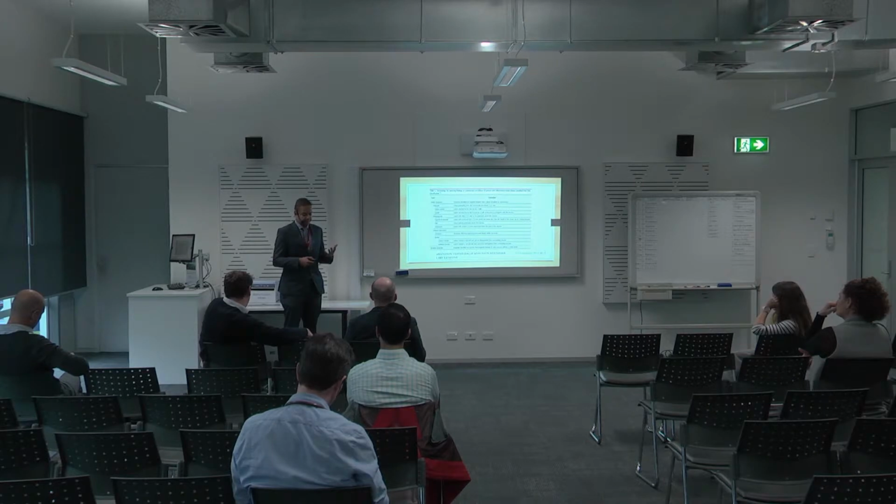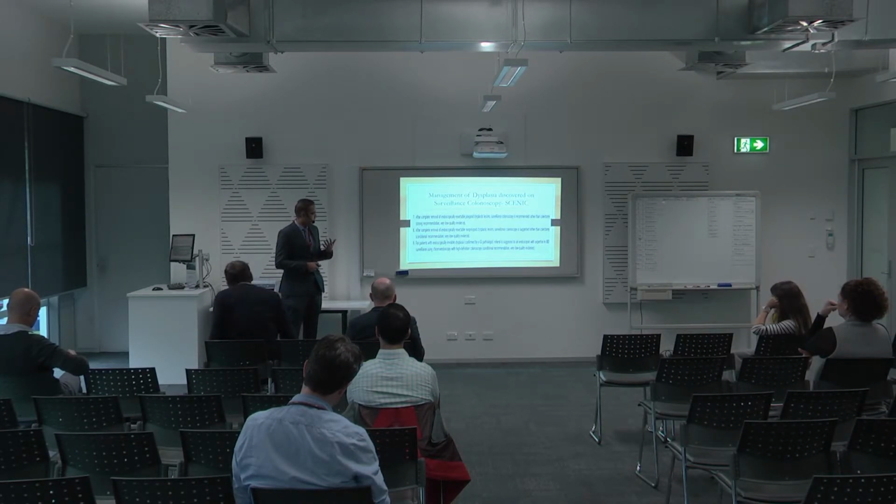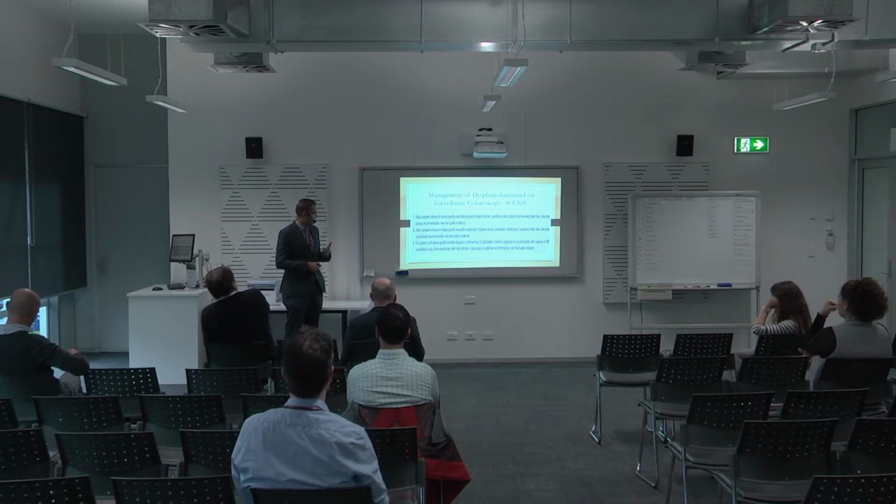As a result, these patients can stay on surveillance rather than colectomy. So that's a change. What the SCENIC people suggested is that you try and remove these and remain on endoscopic surveillance, instead of colectomy.